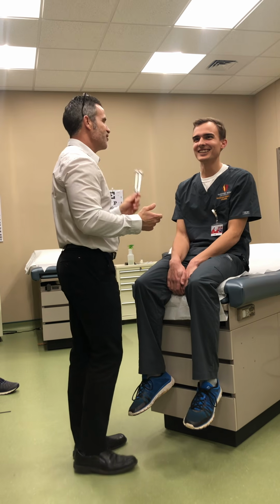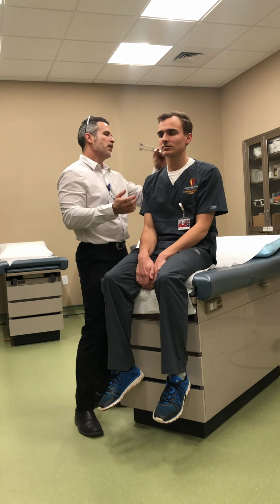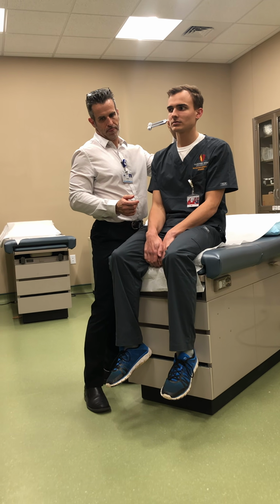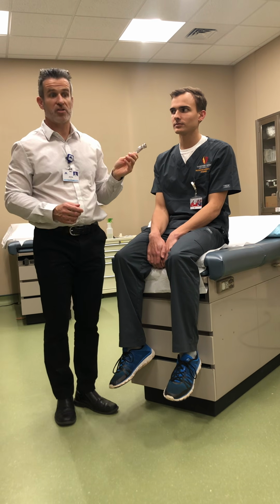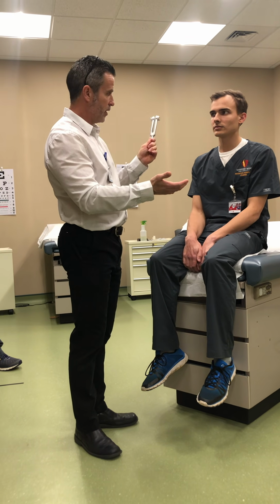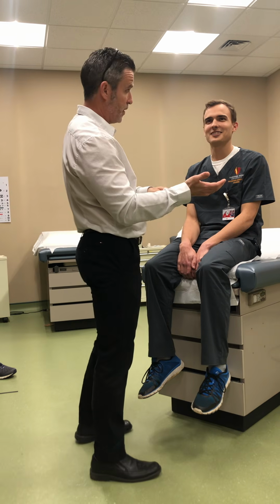So what you want to do is, since he says it's lateralizing to the right, you're going to check the Rinne test on this side. So you don't have to hit it as hard this time. Good. Put this on your mastoid bone. Can you feel it? Mhm. Tell me when it goes away. Went away. You still hear it? Yeah. Okay, so we know it's not conduction. The AC is better than BC. Okay. And with it lateralizing this side, if that's normal, you could have sensorineural hearing loss. So we'll be determined.